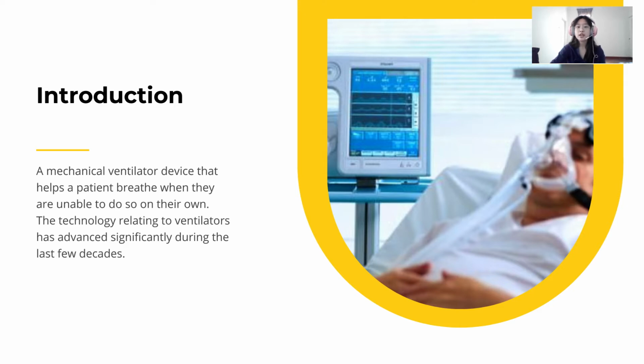Ventilators are mainly classified into two types, which are the manual resuscitator bag, or in other words, the face mask ventilator, and the mechanical ventilator, which is commonly used in the hospital. Next, I would like to pass on to Fujin to present the manual resuscitator bag ventilator.